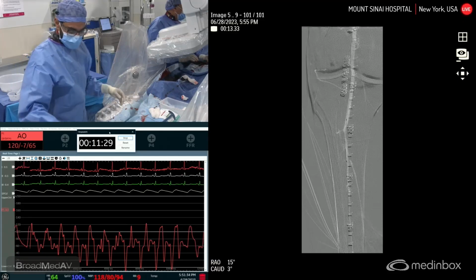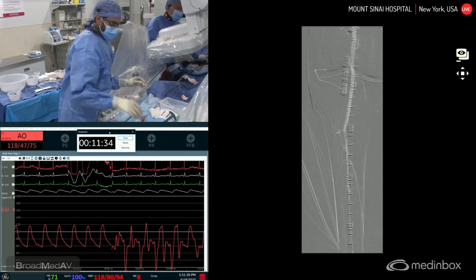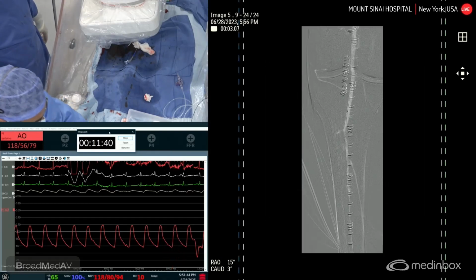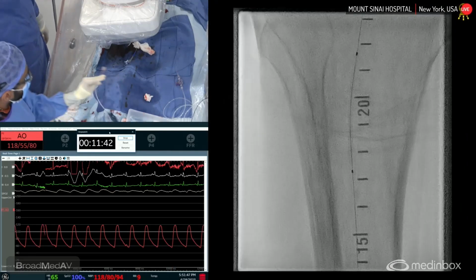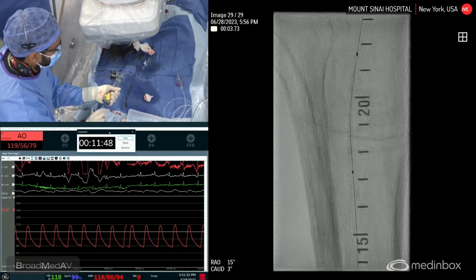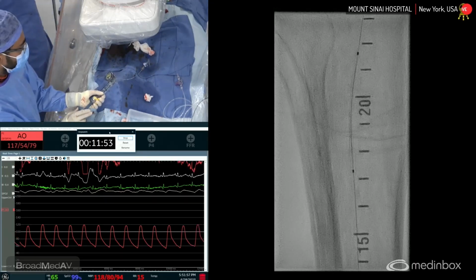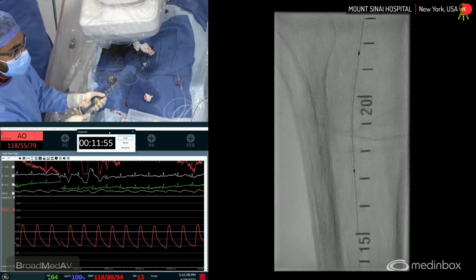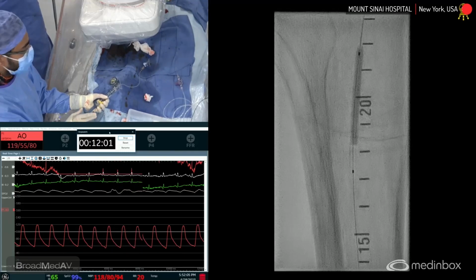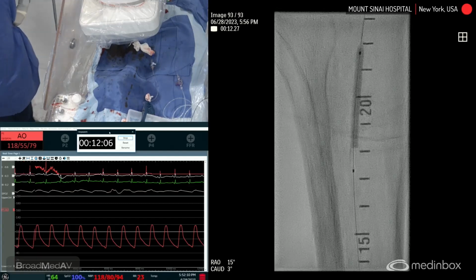Right there. I'm across it there. I'm gonna come back a little bit. Yep. Okay. Good. A little more right there. Okay. So we're just gonna show you how this works. One second, sir. So we're going up to a pressure of 4 first, just to engage the blades. And I'm at 4. We keep it up at 4 atmospheres for a minute, so we allow the blades to do their work.